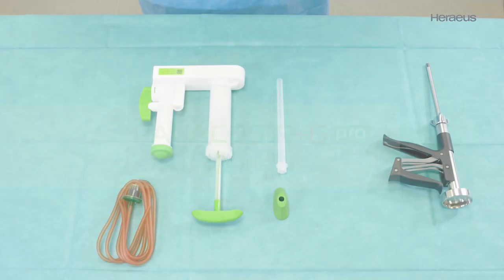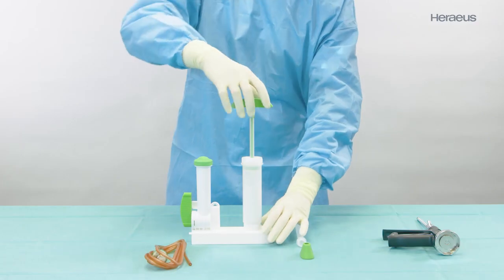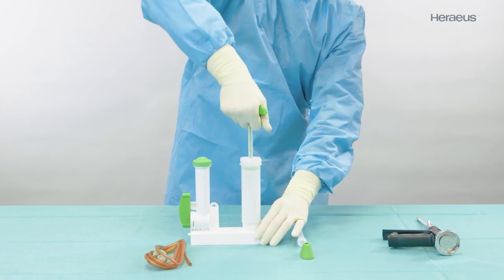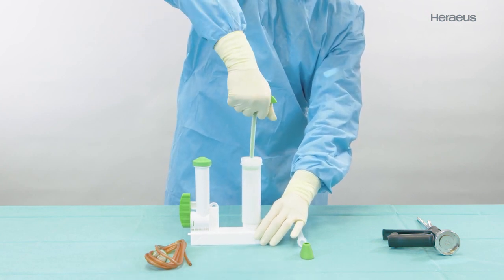Mixing. The green label should be facing towards the user during the mixing process. Push the mixing rod twice through the cartridge to loosen up any possibly compacted powder and return to its initial position.